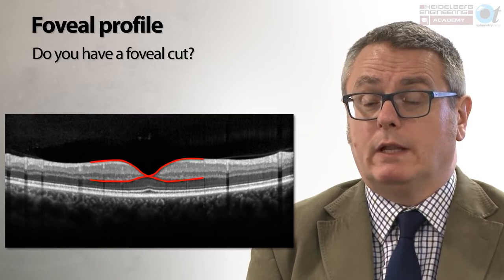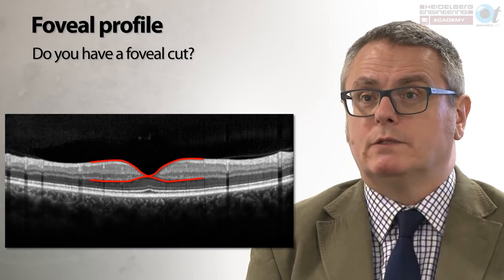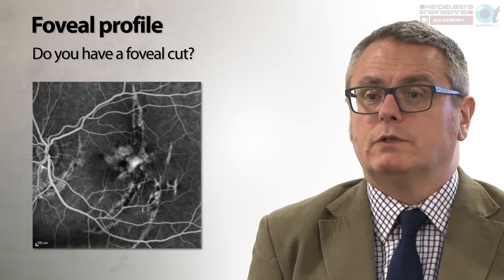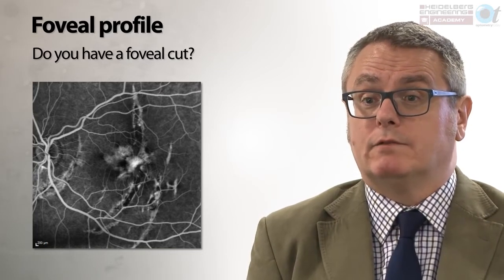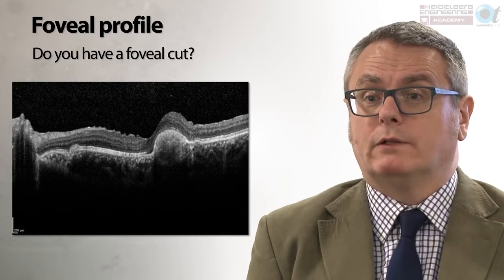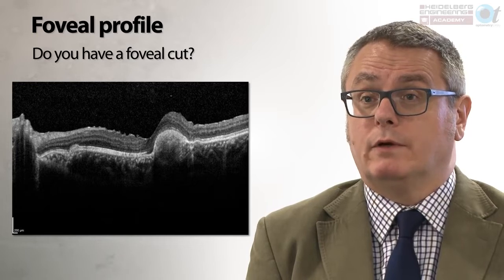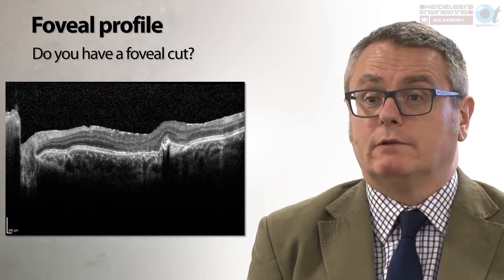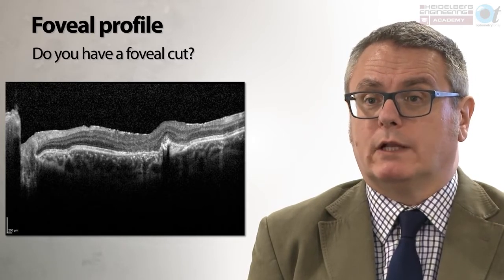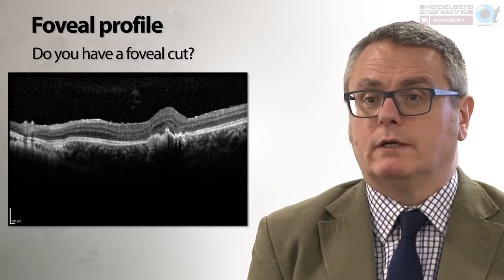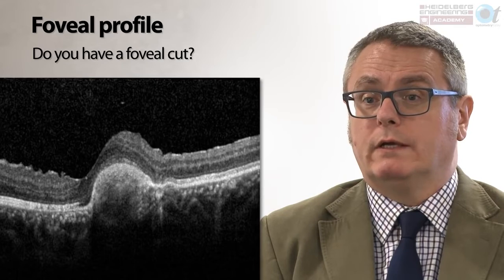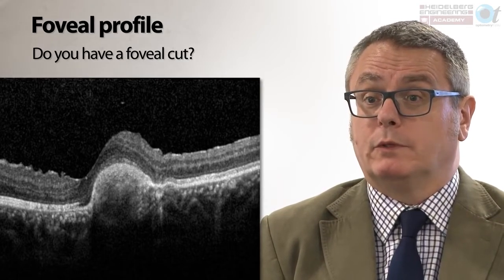Have you been able to identify the fovea on your scans? Look for the position of the retinal nerve fibre layer and the outer plexiform layer — they appear to meet at the fovea, confirming a foveal cross-section. When the scan position is moved superior or inferior to the fovea, the retinal nerve fibre layer and outer plexiform layer appear continuous across the length of the scan rather than converging. Returning to the central fovea, those layers meet again, confirming a foveal cross-section.